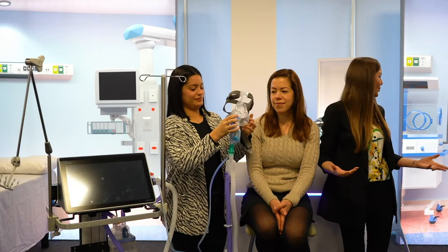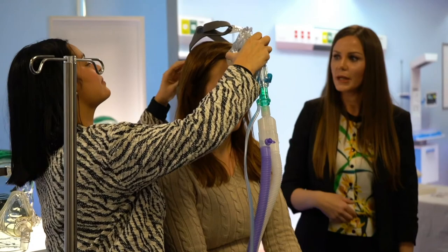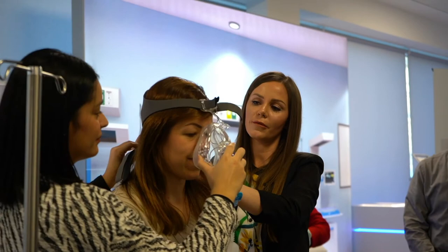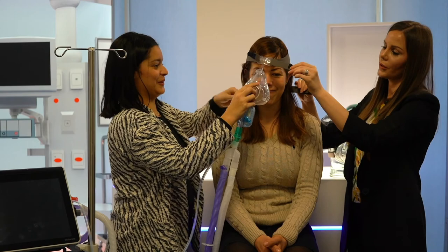Right, next thing, you want to place it over the patient's head, okay? And this bit I will help you with, okay? So we're going to place it over the patient's head. Now I see the top straps. Let's loosen them a little bit. There we go. And maybe just move the hair out of her way. There we go. I've just put it behind the ears. So let's secure these top two straps again.